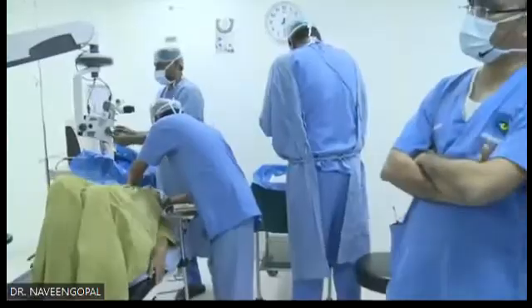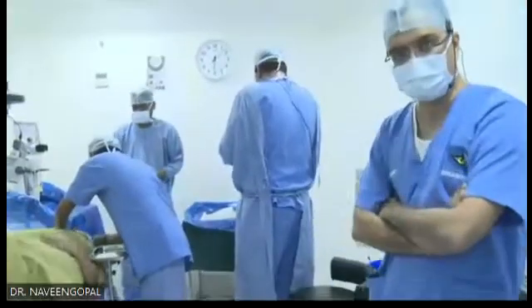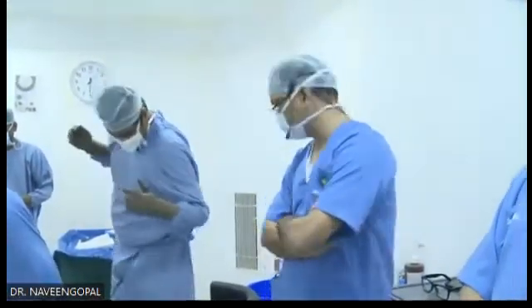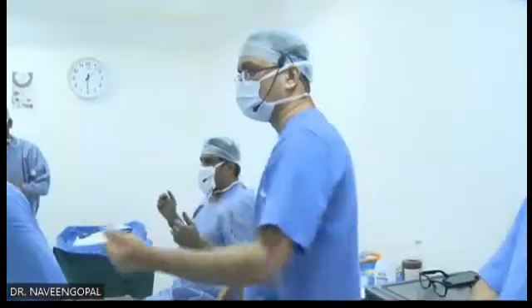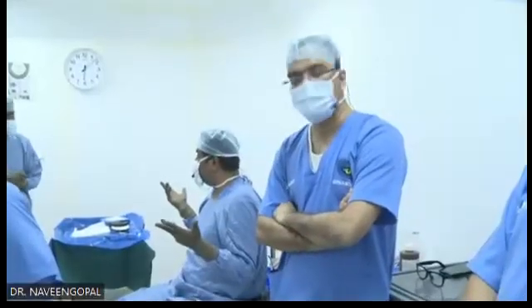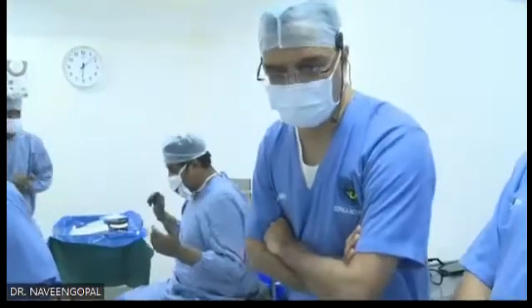So now we are going live for multifocal. That is also from Biotech, with the lens box. They have Trio also, that is trifocal.